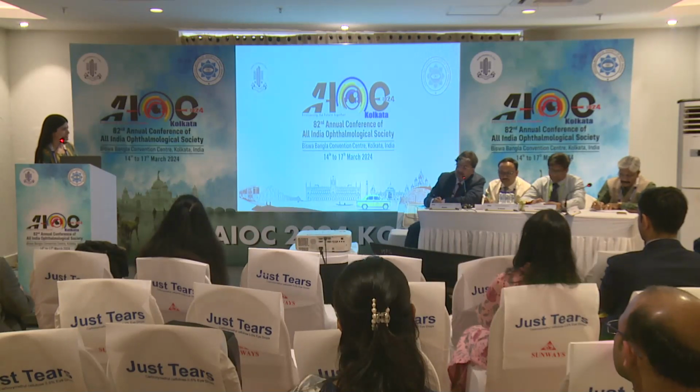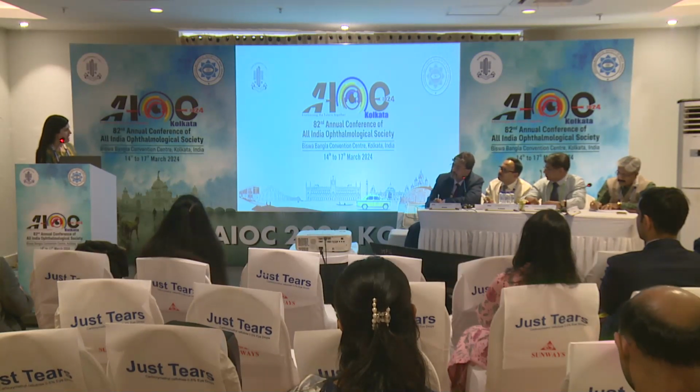Yes. And what IOL do you prefer usually? I prefer an IQ because that has very good foldability, and it acts according to the surgeon's direction. So we can manipulate it very nicely.